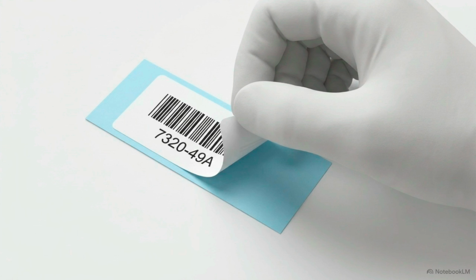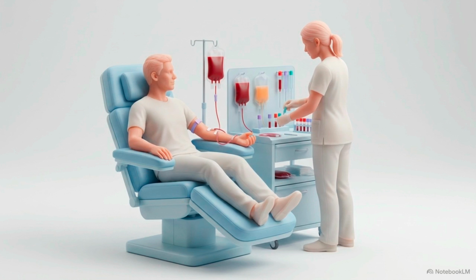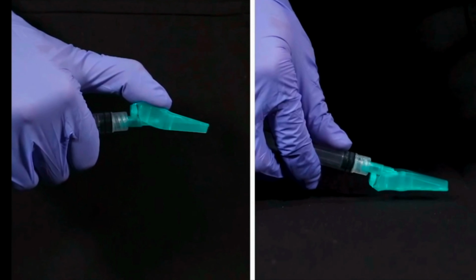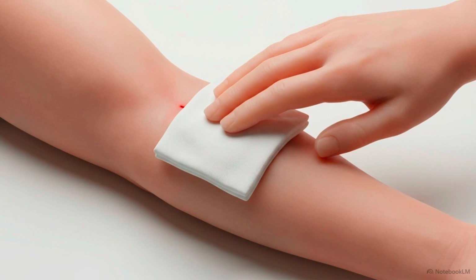Apply unique identification barcodes to the primary bag and the satellite bags and pilot tubes while standing at the donor side. Withdraw the needle in one smooth motion and immediately engage the plastic safety shield securely over the sharp needle tip. Discard the shielded needle straight into a yellow biohazard container, then instruct the donor to apply firm pressure to the puncture site using a sterile gauze.